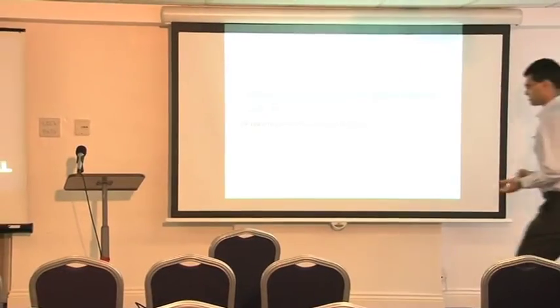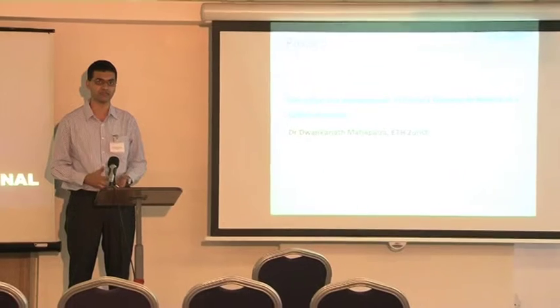Good afternoon, everyone. In my work, I look at the relevance of detecting and segmenting Crohn's disease from MRI. When we started out on the project, we had labeled data on the retrospective images. We used that to train classifiers and design an automated method for segmenting. But as has been hinted at in the previous presentations, obtaining labeled data for such a reliable methodology is difficult and time consuming because you need expert annotators.